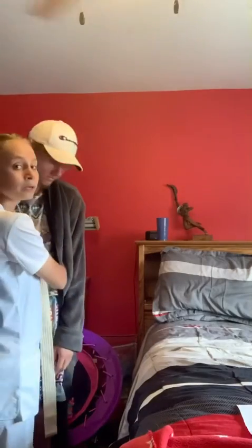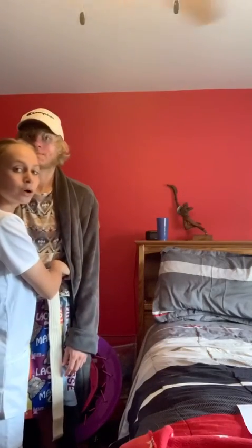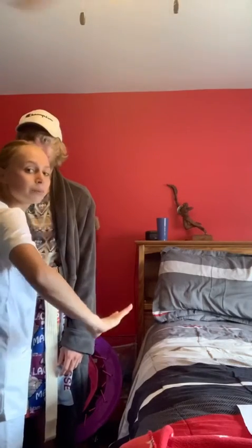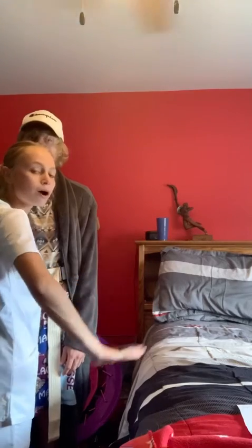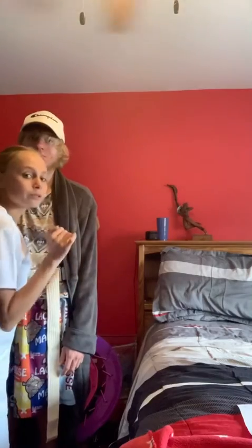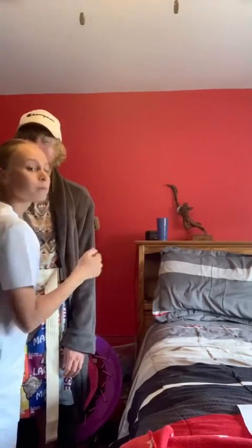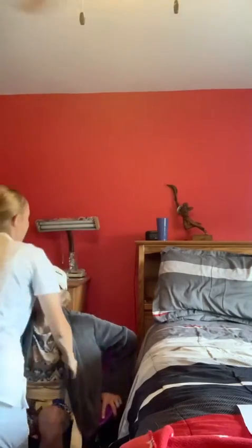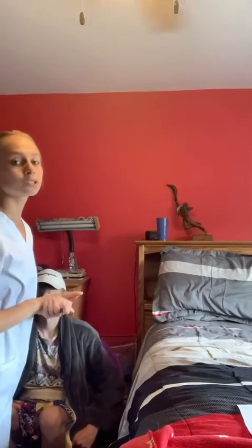And now on the count of 3, he is just going to put his arms on the armrest of the wheelchair, and he's going to bend them as he's sitting down, and I'm just going to bend my knees as I am helping him sit down. So 1, 2, 3. And now after this, I am just going to lock the bed wheels. So the bed wheels are locked, and now I'm just going to position him in good alignment and make sure that he is comfortable.